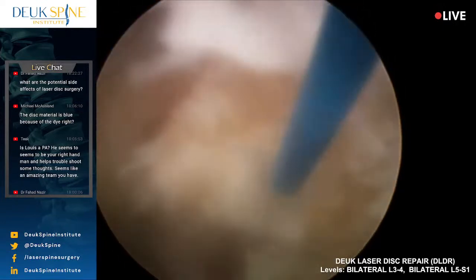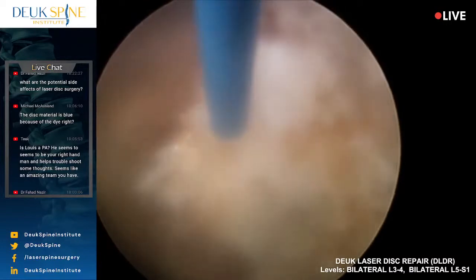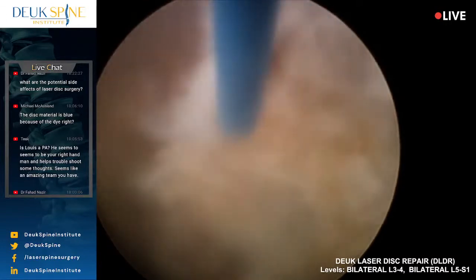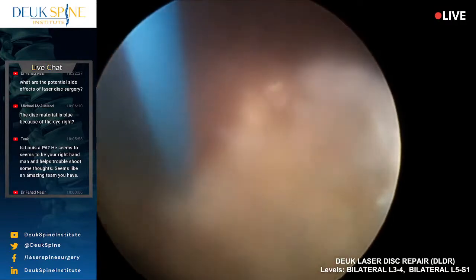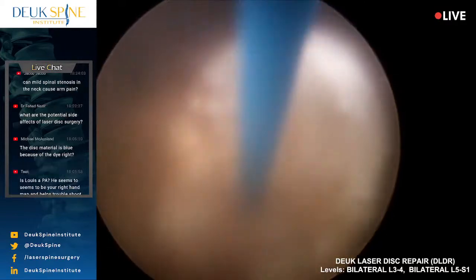What's going on with my irrigation? Okay. No.